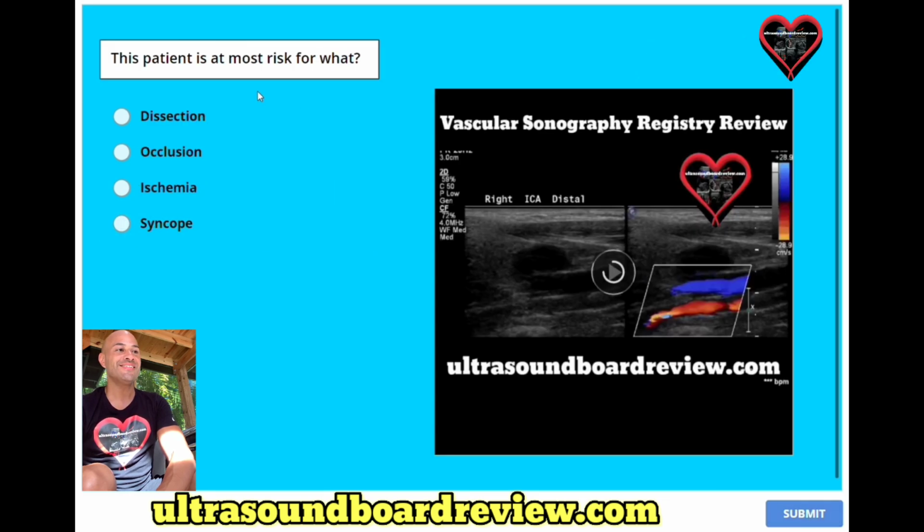Question 18. This patient is at most risk for what? A, dissection, B, occlusion, C, ischemia, or D, syncope?